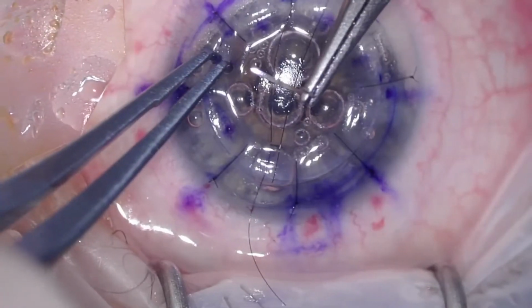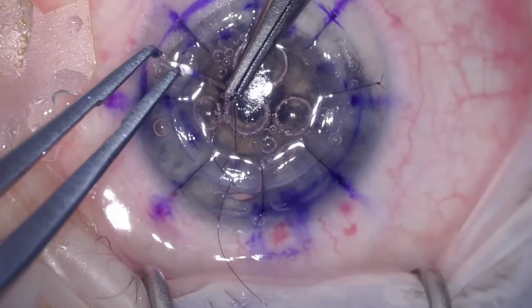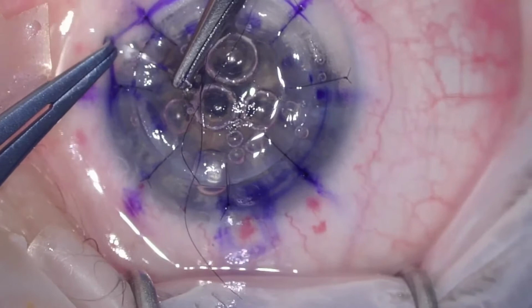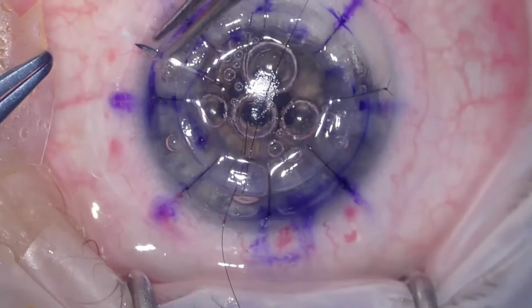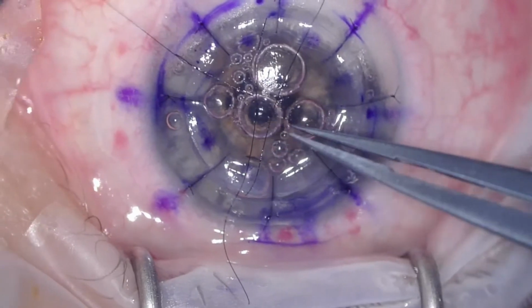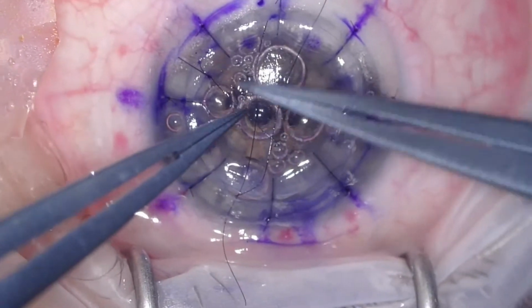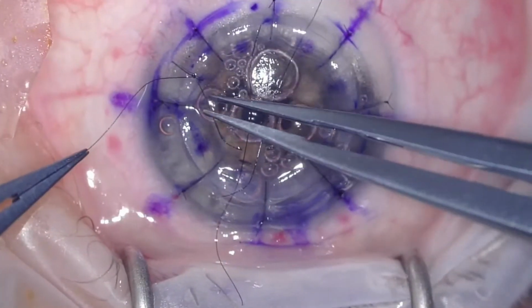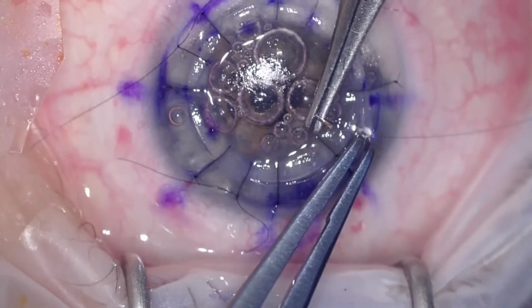Now, microperforations or minimal tears shouldn't pose a problem, but you don't want to end up with a double AC later on. So if you put a tiny amount of an air bubble, maybe 50%, this should be enough, especially with the location of the suspected tear, to hold the Descemet's in place while the patient's recovering. Now I'm tying the remaining sutures, just finishing off the 16 sutures that I'm placing in. And I'm making sure the tension is as equal as possible amongst all the sutures so you don't get any excessive tension on one side compared to the other.